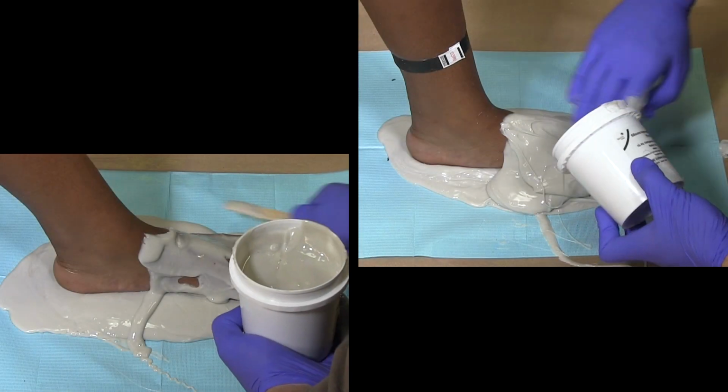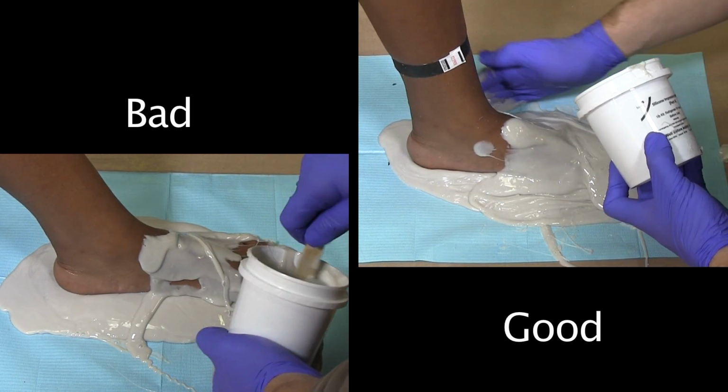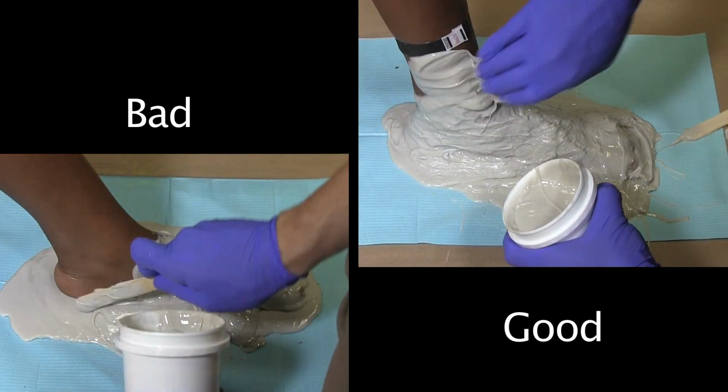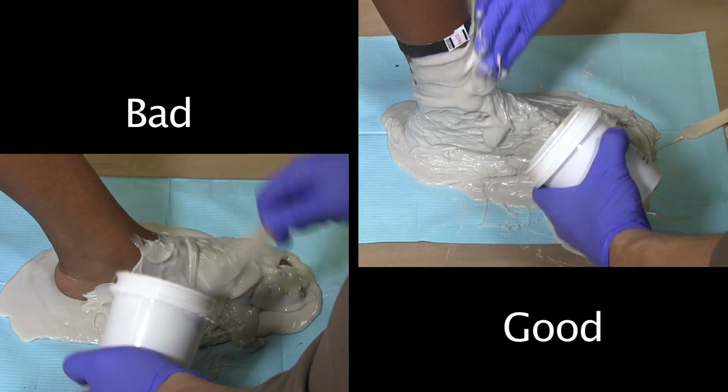Apply the impression material evenly and use excess material to fill in any holes or thin spots that may appear. Remember to apply impression material up to the ankle bands for adequate coverage.